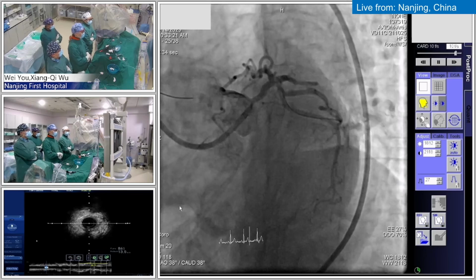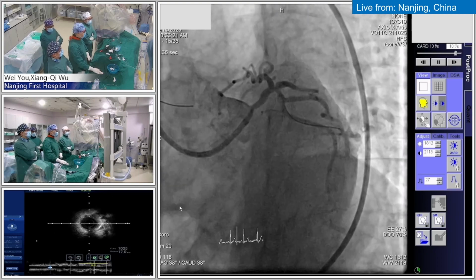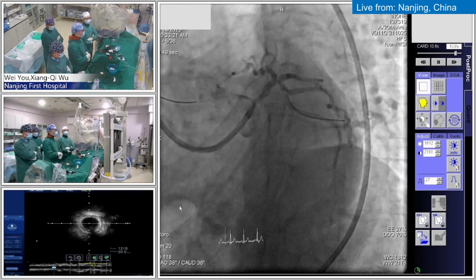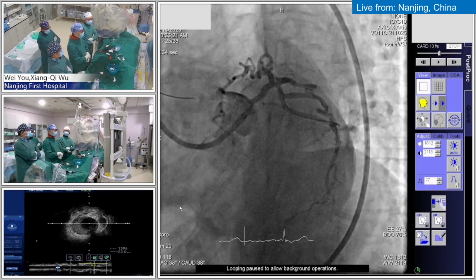Just a straightforward observation, both rooms I noticed were Siemens. They've had decades of exceptional imaging equipment. The room is about twice the size of the previous room, and of course, the excellent team which we always watch on Medstream 360 is there. My pleasure being here.